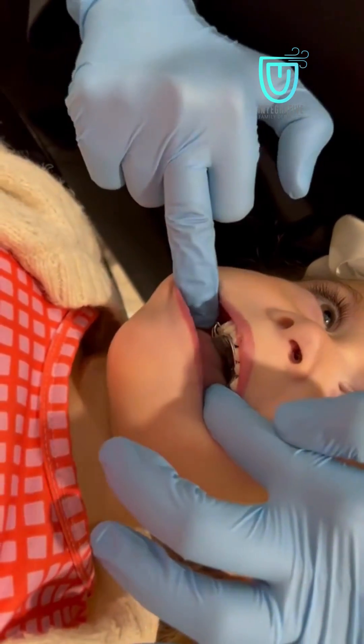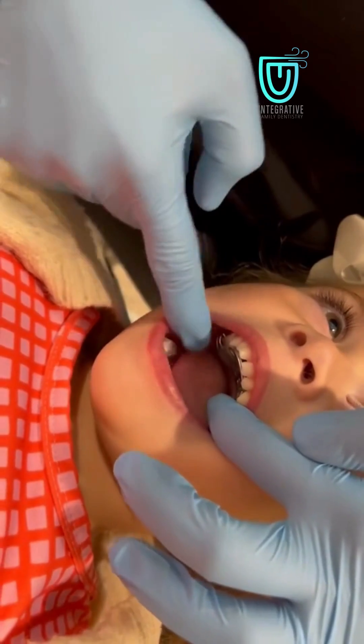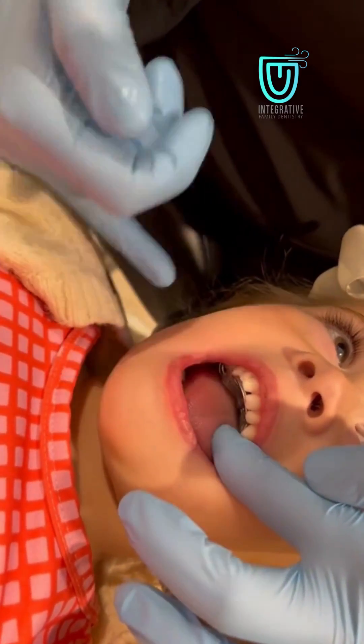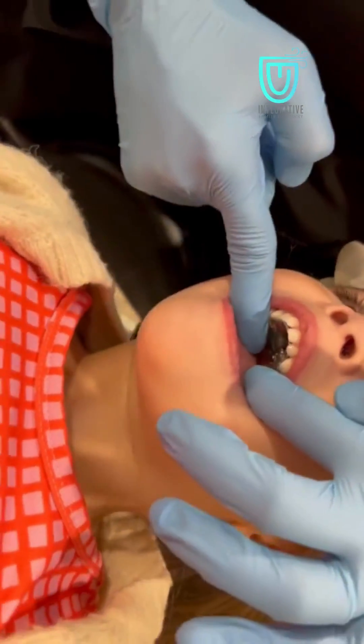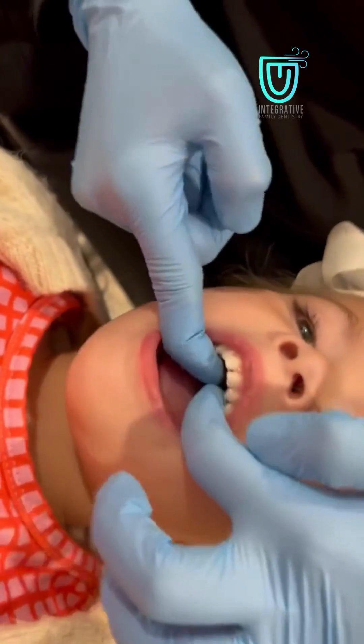Then I hold this index finger and let go of the one I've been holding. Just want to make sure it's lined up with the tooth. Then you press on this acrylic — the plastic part on the inside — you push that out towards her ear until you hear a click like that. Then just push, push, push, push — make sure it's a tight fit.